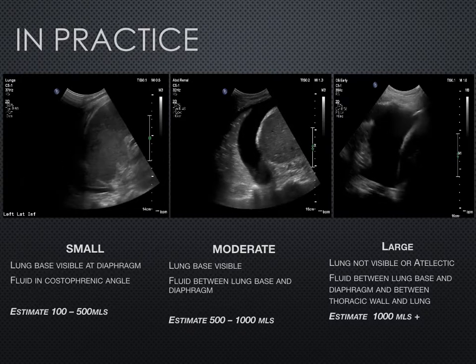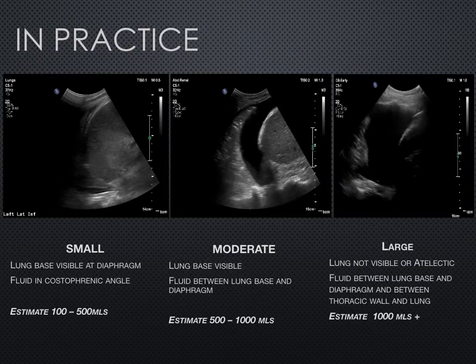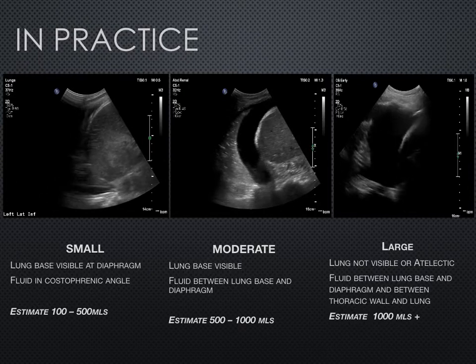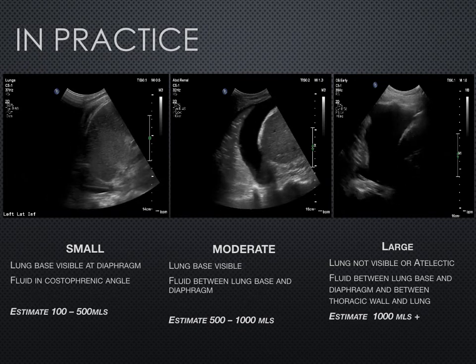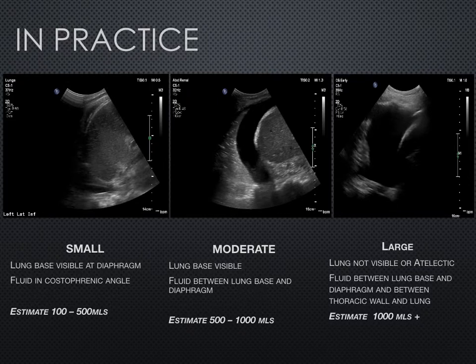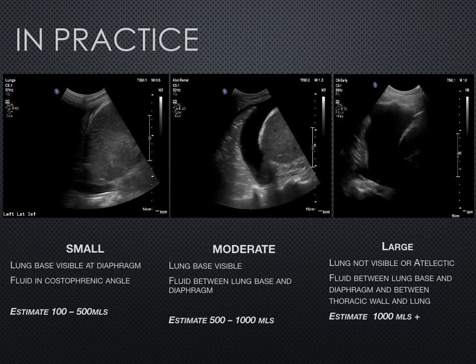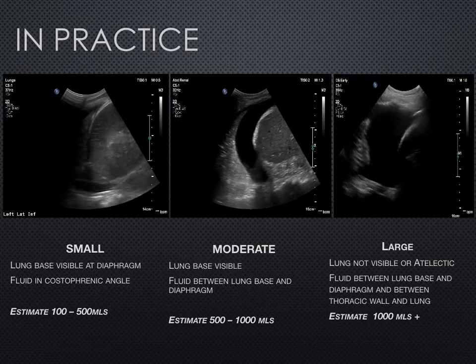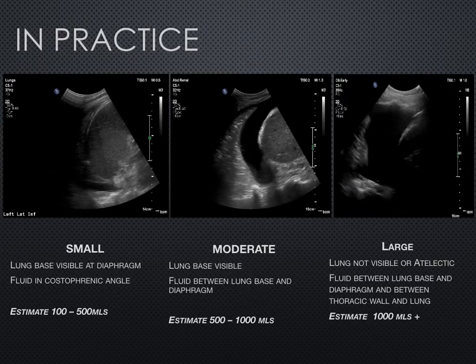However, the value of lung ultrasound sits not only in interpreting whether it is a small, a medium, or a large effusion, it's also in interpreting what's going on with that lung itself and what's going on with that fluid within that cavity itself.